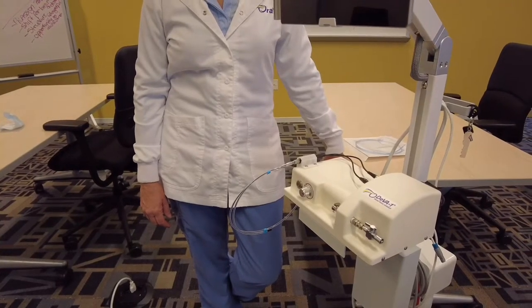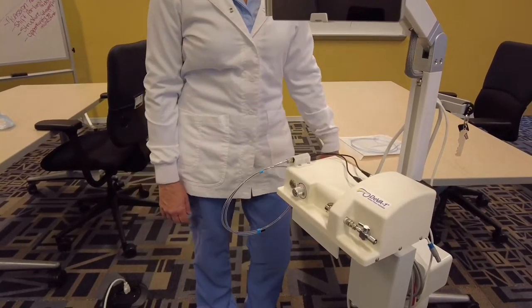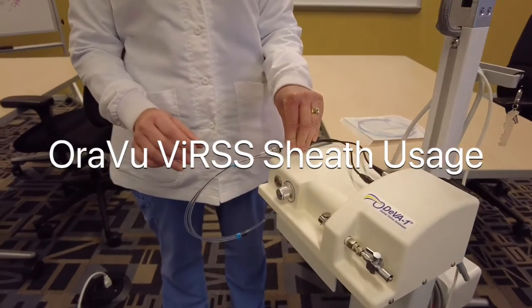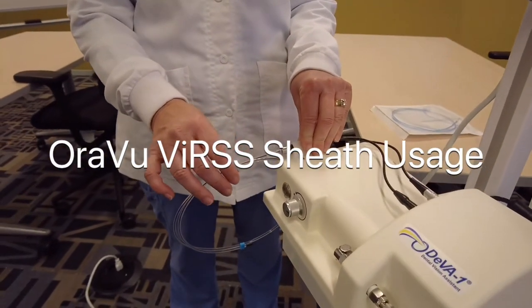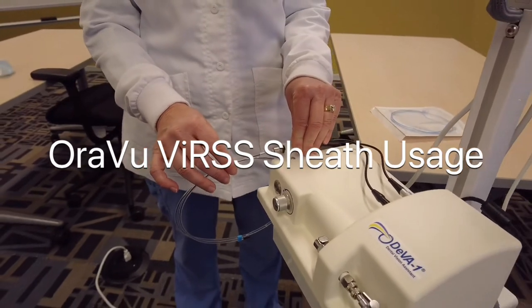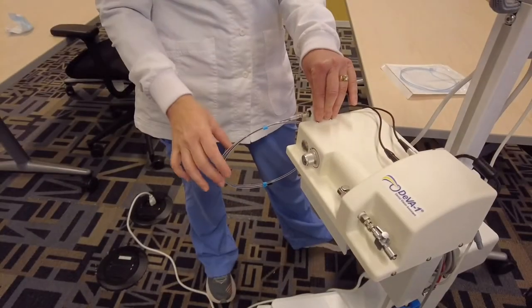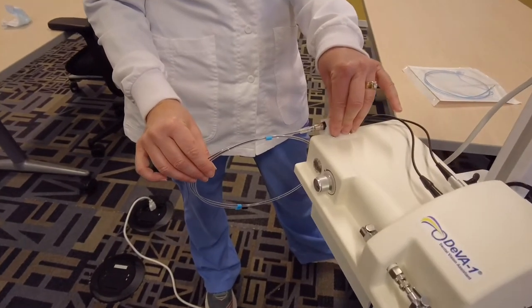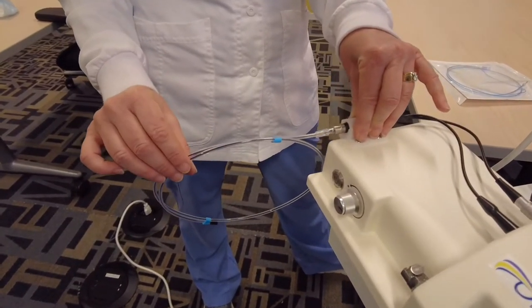In this video, we are going to demonstrate how to apply the protective sheath on the DivaOne Digital Camera Fiberscope by AuraView. This is how your fiber is stored in between patients in this protective covering.